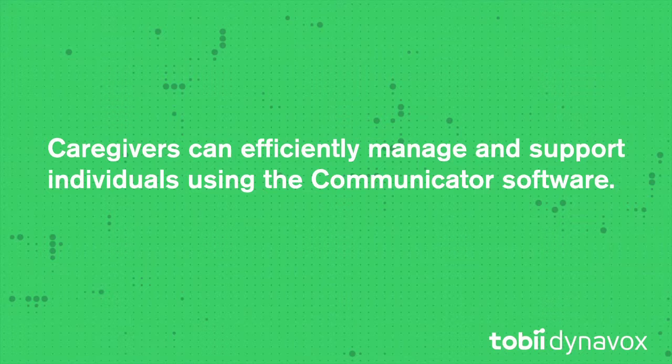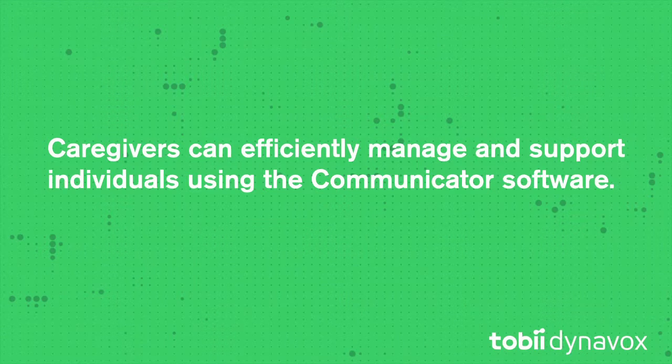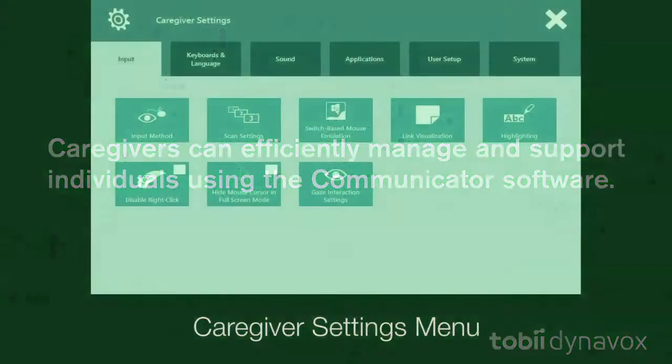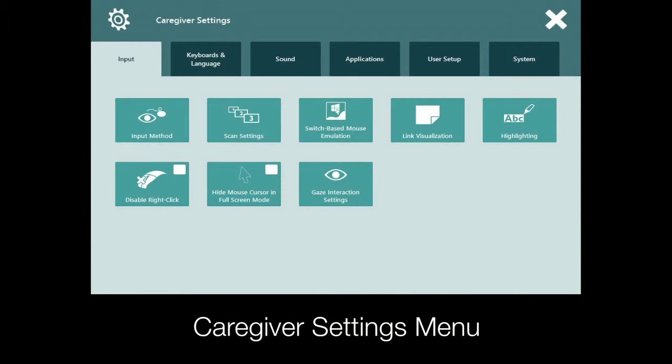These menus can only be accessed using the touch screen, keyboard, or mouse. I'm going to focus on the caregiver settings menu and give you a little tour of the tools available that will help you better support the individual using the software.